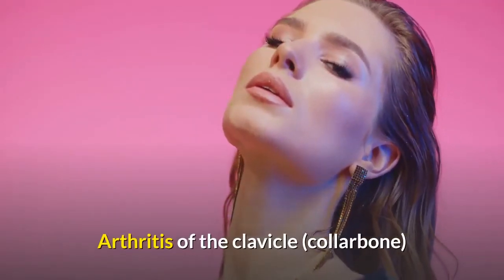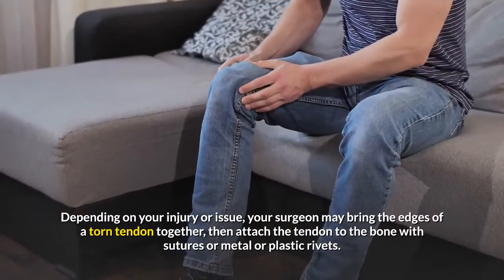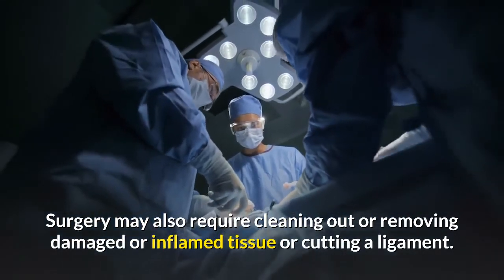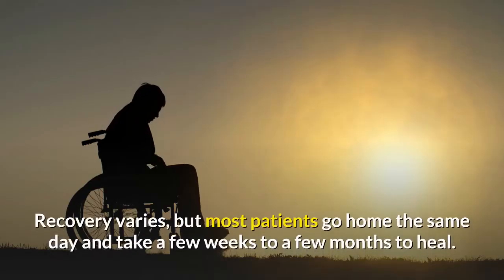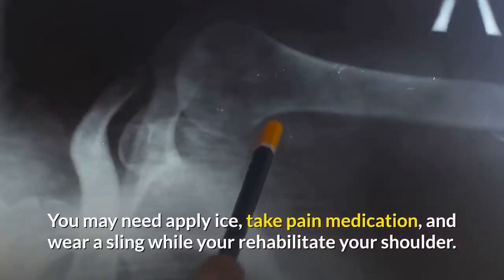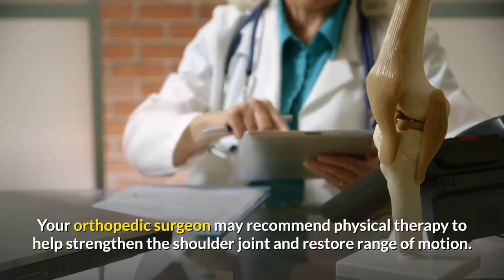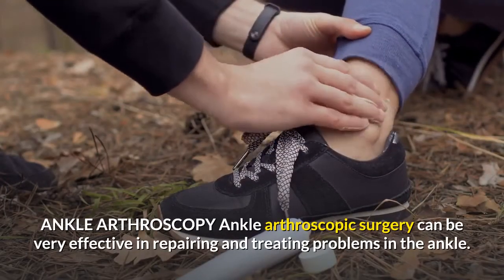Arthritis of the clavicle (collarbone) can also be treated. Depending on your injury, your surgeon may bring the edges of a torn tendon together and attach the tendon to the bone with sutures or metal or plastic rivets. Surgery may also require cleaning out or removing damaged or inflamed tissue, or cutting a ligament. Shoulder procedures take about one hour in an outpatient surgical center. Most patients go home the same day and take a few weeks to a few months to heal. You may need to apply ice, take pain medication, and wear a sling while you rehabilitate. Your orthopedic surgeon may recommend physical therapy to help strengthen the shoulder joint and restore range of motion.